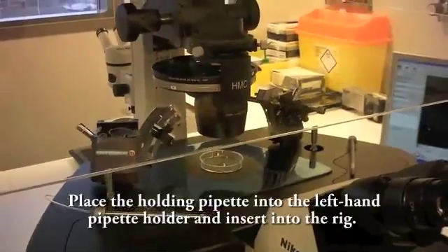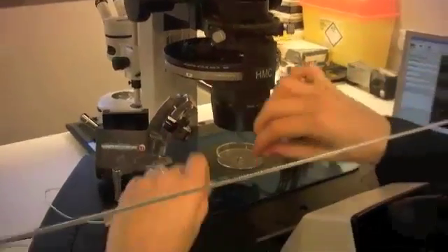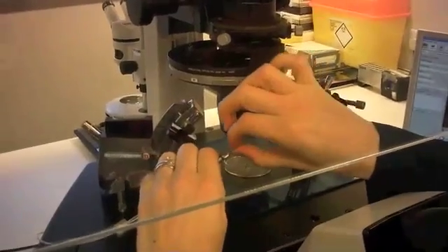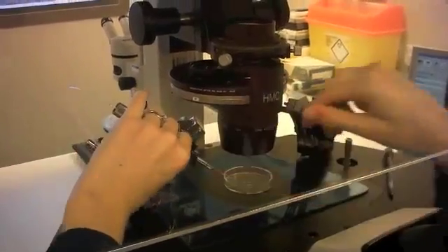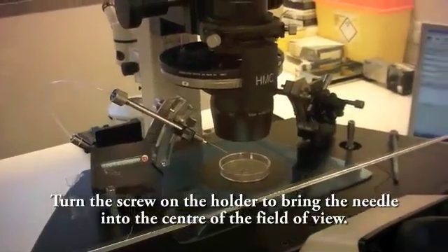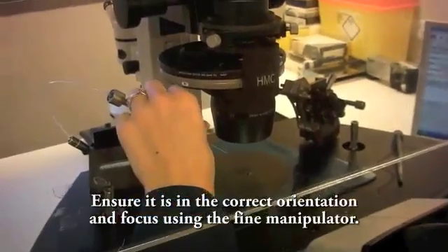Place the holding pipette into the left hand pipette holder and insert into the rig. Turn the screw on the holder to bring the needle into the centre of the field of view. Ensure it is in the correct orientation and focus using the fine manipulator.